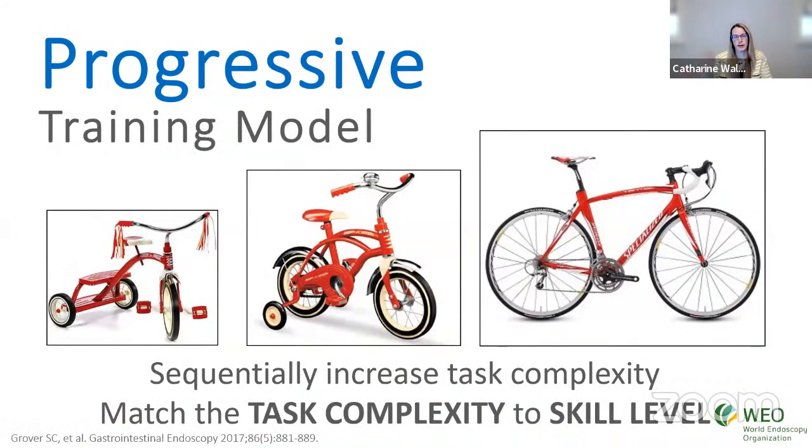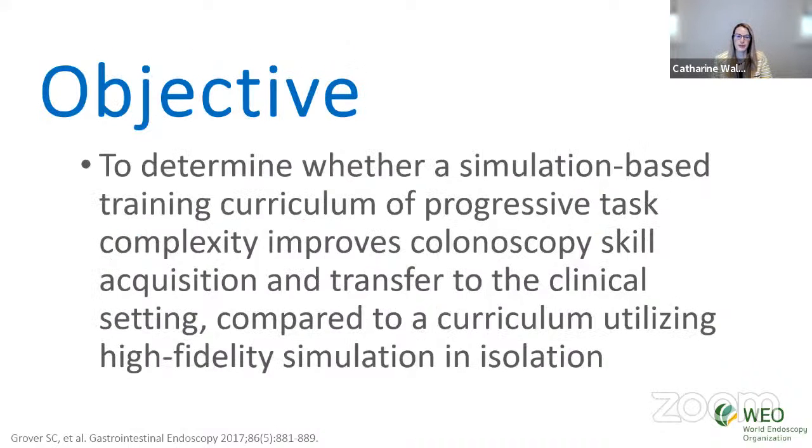There has been initial research from other clinical skills that you could potentially match the simulator to the task that you're doing, and this would allow people to learn the task better. This is akin to learning to ride a bike. When you start to ride a bike, you don't start on a two-wheeler, you start on a tricycle, and then as you master that, you get training wheels, and you get to take the training wheels off, and then you're on a two-wheeler. So we carried out a study to look at whether a simulation-based training curriculum that incorporated this progressive task complexity was able to improve performance in the clinical setting as compared to just doing full cases on a simulator.